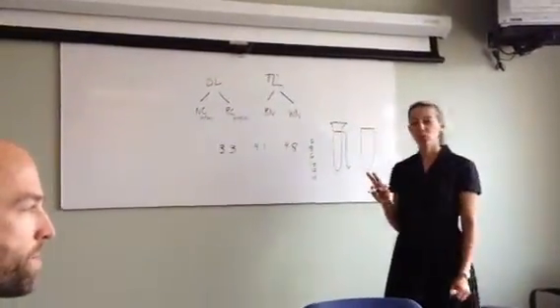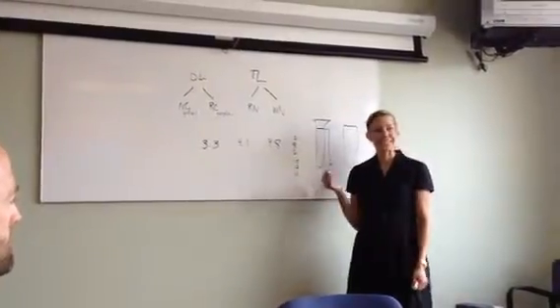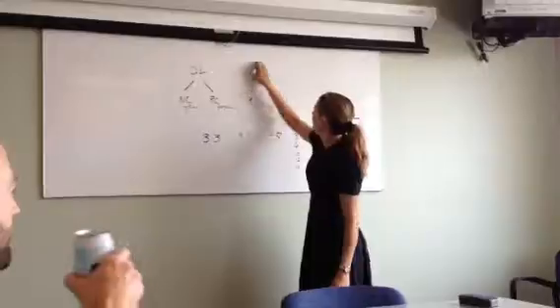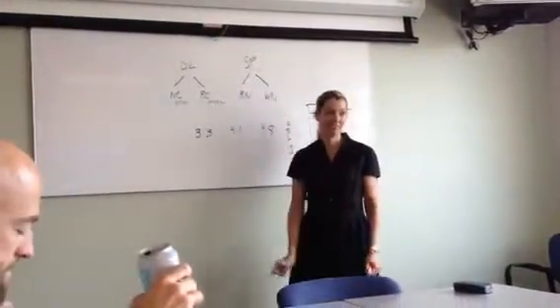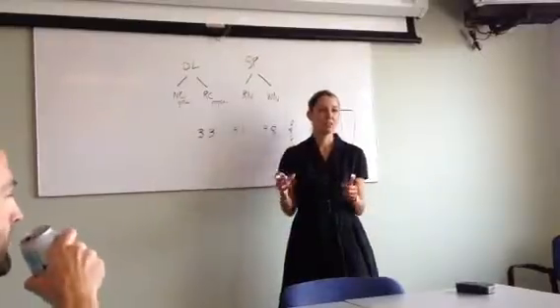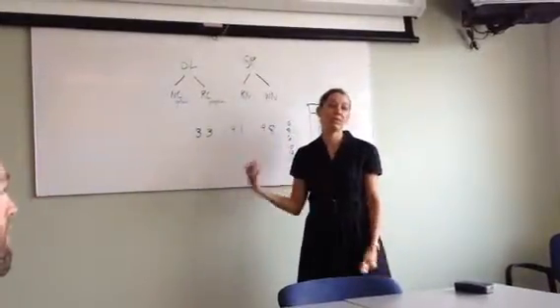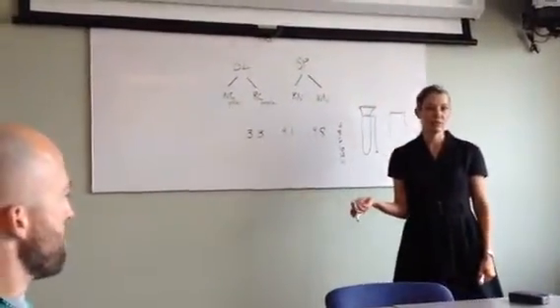But if you're looking at a box with an implant on it, it doesn't say tissue level. What it says, if I was to be really accurate, is SP on it. Okay. So sometimes if you have to grab a box with an implant, you need to know that SP is always going to be the designation for tissue level. And you see that in the surgical kit also.